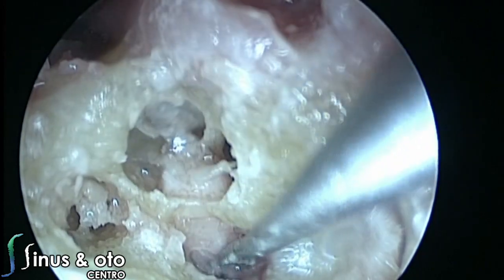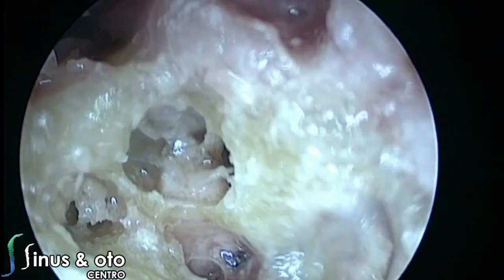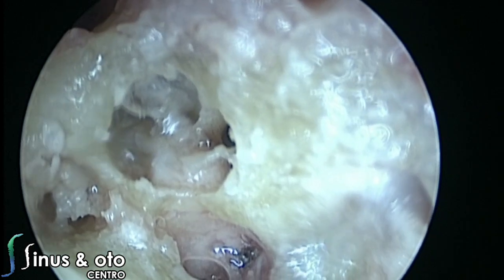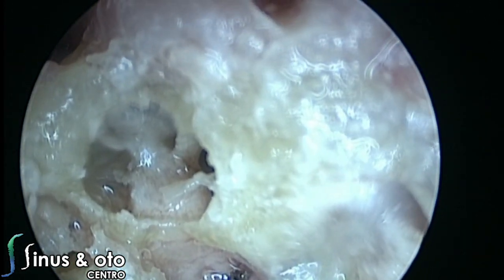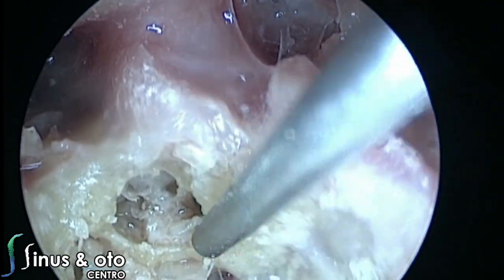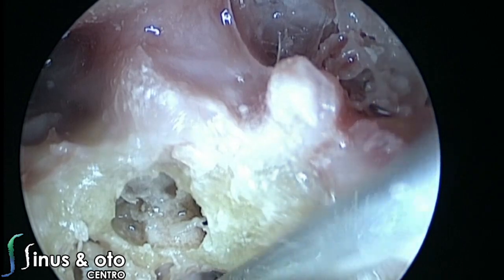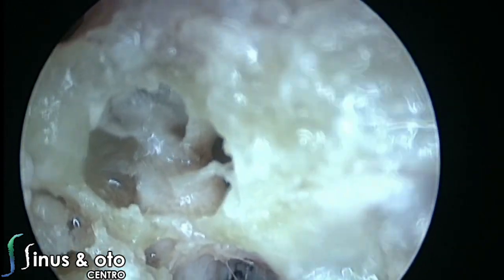So we open the fundus of the internal auditory canal. There is some arachnoid over there, and we can use a suction to delineate the anatomy better. Of course, in real life, in a real patient, we would do a much bigger exposure in order not to injure any cranial nerves except the cochlea that we open, of course. And then once we aspirate there, we can see the cranial nerves.